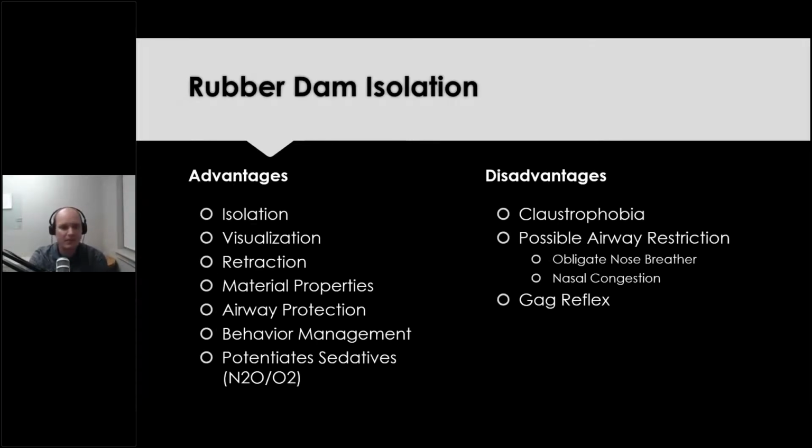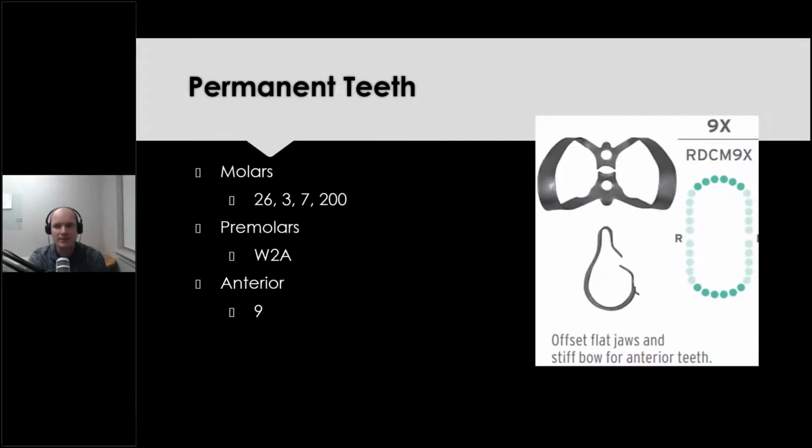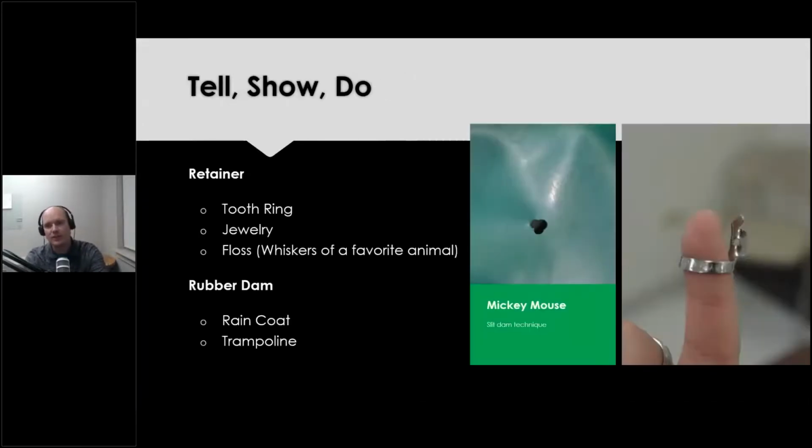Rubber dam isolation, I'm going to skip this in lieu of time. We'll cover this a little bit more in depth in the hands-on section that's going to be offered next month in December, and I'll cover a lot of other techniques. But just some of the retainers from Joel Camp that you can use that are useful for you. It's really easy. It's not that hard to place a rubber dam.